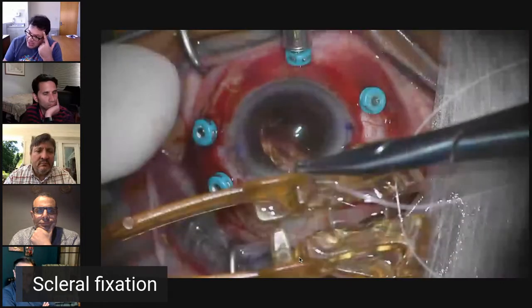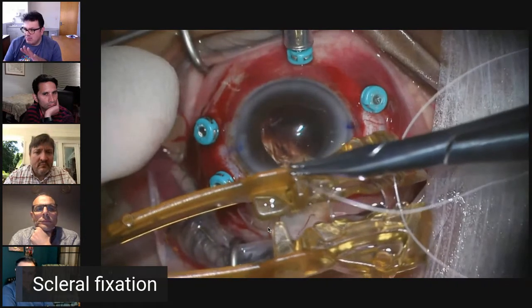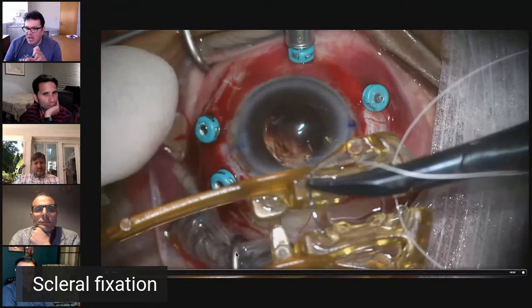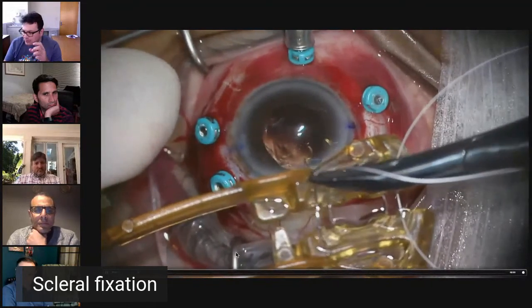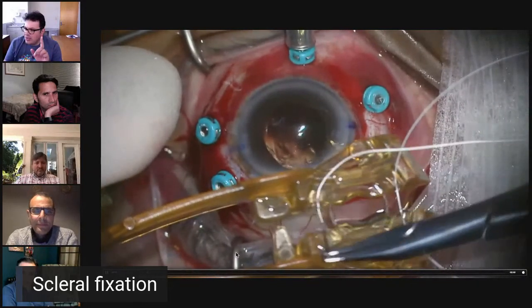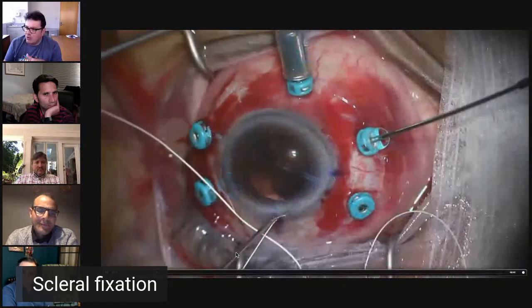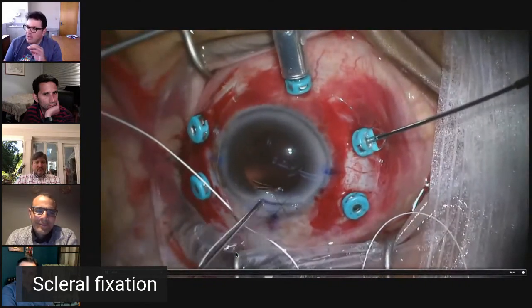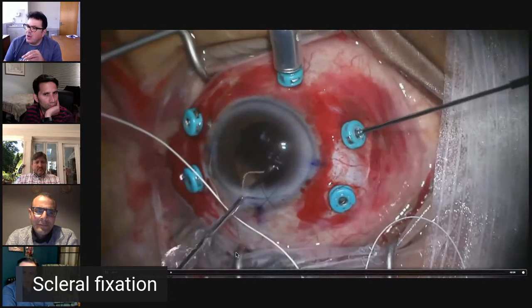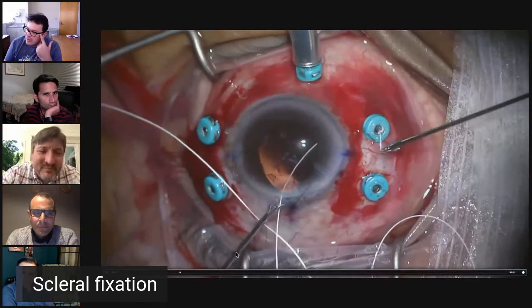Then the next thing here, where you can see the 5 trocars, which I tend to use this way, is I thread the Gore-Tex suture as I hold the lens in its manipulator. I just find it easier. I do that with the needle on, and then after that, I cut the needle and put it in. I try to be very organized. So I always do the inferior one first. On one side, I try to do the nasal first because it's more difficult.